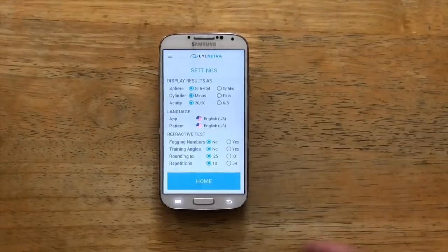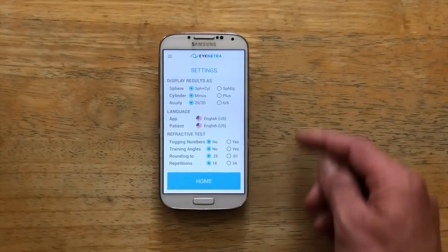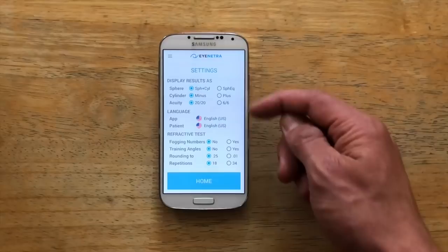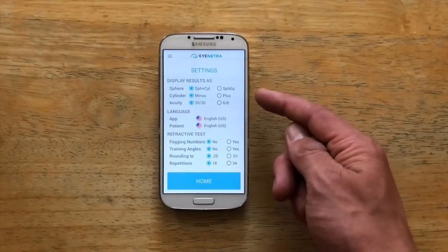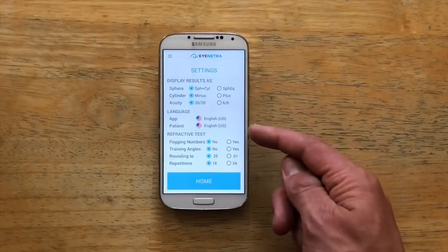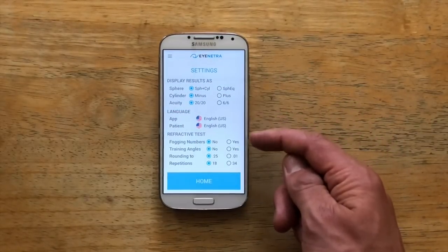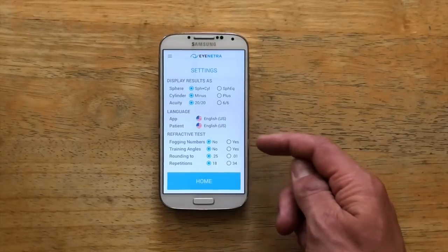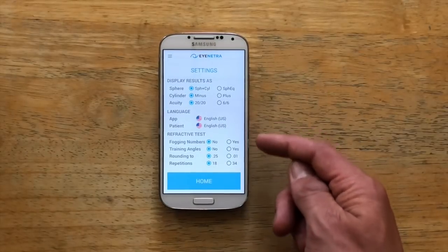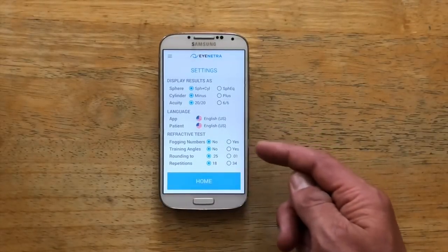The screen is broken up into three major sections. At the top we can make some adjustments to how our results are displayed. In the center we can change the language of the application for both you and the patient, and on the bottom we can make some changes to the refractive test itself.